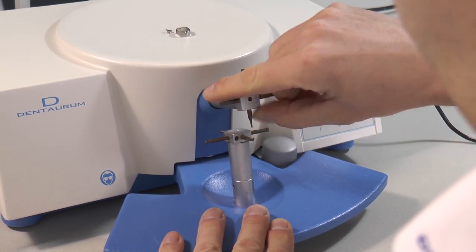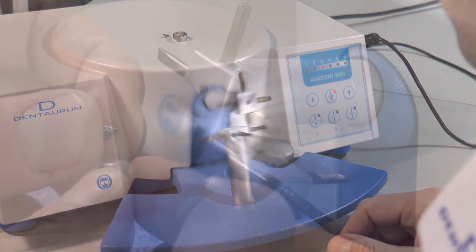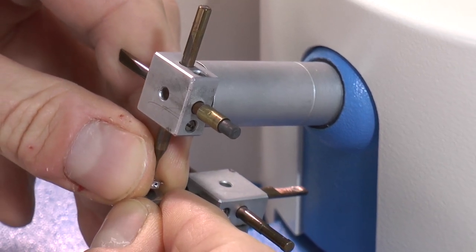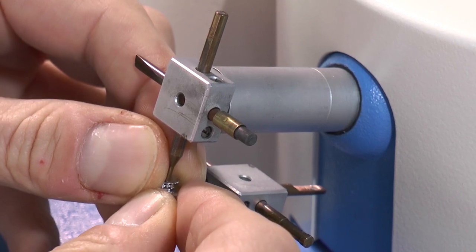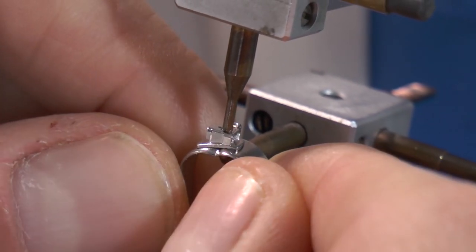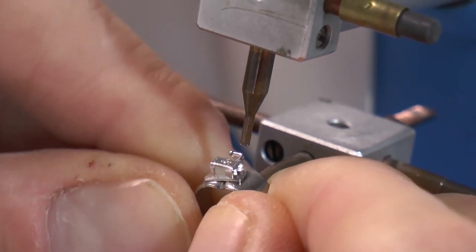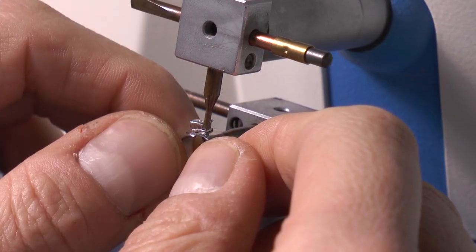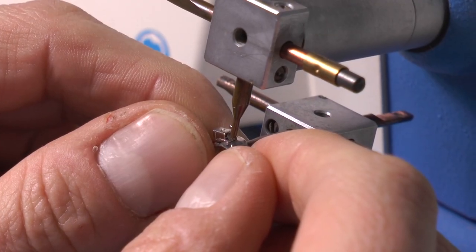And here we go. A good welding spot lives from the pressure on the workpiece. Normally the spring inside takes care of the right fixation. Multiple welding on one point usually does not improve the quality of the welding spot. If there is enough space, apply single spots on several locations — that makes the joint more stable.